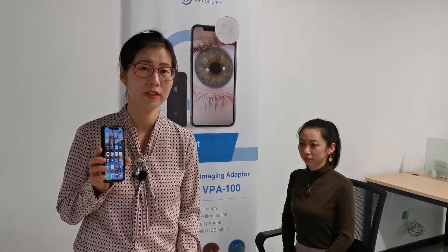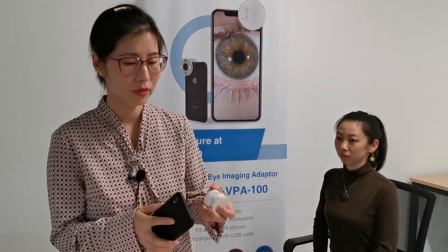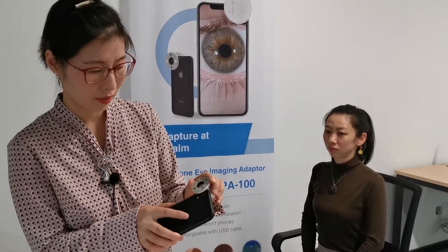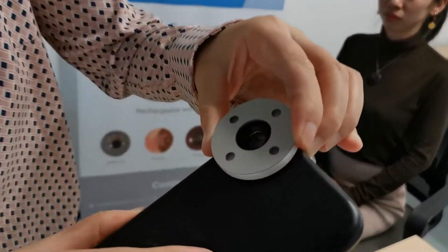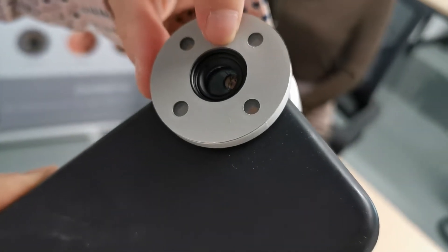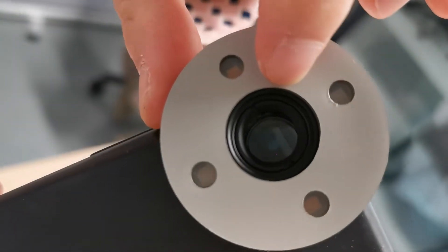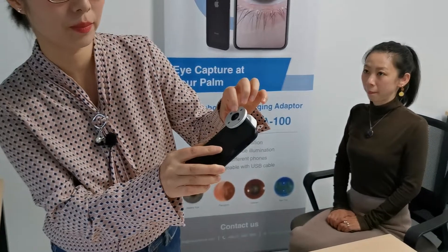Now let's see how we can use QuickView to capture anterior segment images. Let's take an iPhone XR as an example. First, you need to open the phone camera and then attach the adapter onto the phone case. You need to make sure the adapter lens is 100% in line with your phone camera lens. For phones with several cameras, you need to find the main camera lens and align with it.